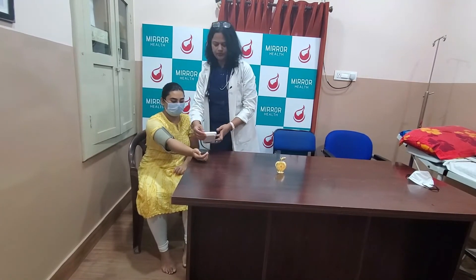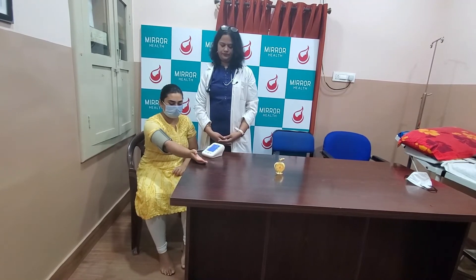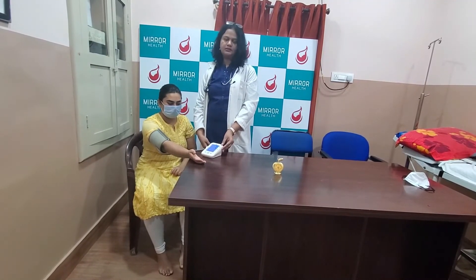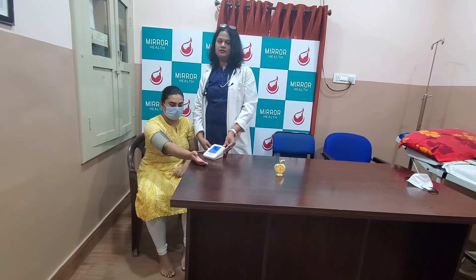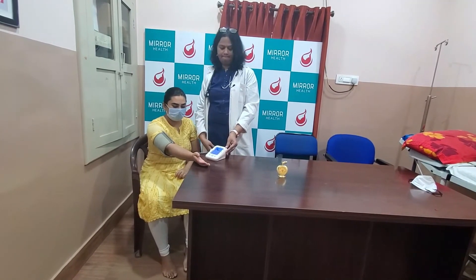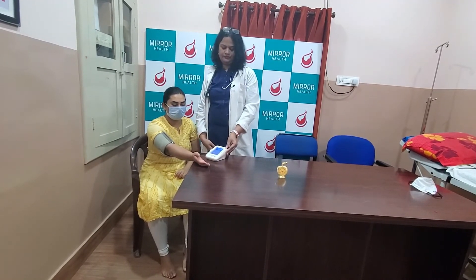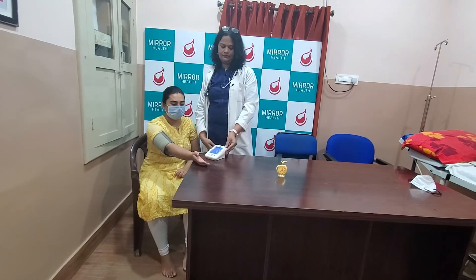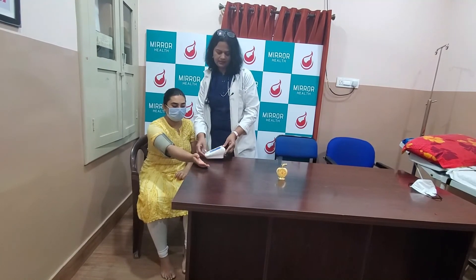With this I am probably going to record the blood pressure. I am going to press the start button and wait for the values. This is a properly validated blood pressure meter which is an automated device. It is very difficult for us to procure the mercury sphygmomanometer because of the hazards that are associated with mercury.